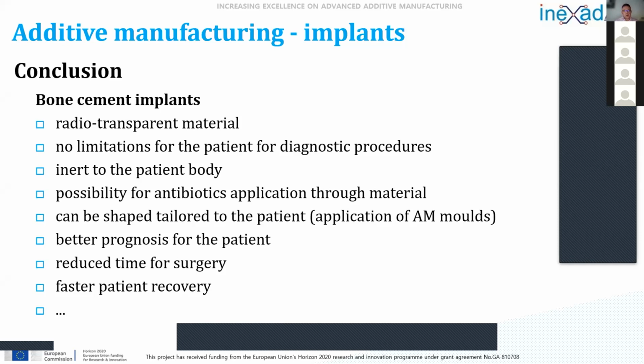With application of additive manufacturing molds, we can really adjust the shape of the implant made from bone cement, tailored to the patient. Those examples are not in this presentation, but we have solved much more complex geometries with this approach.